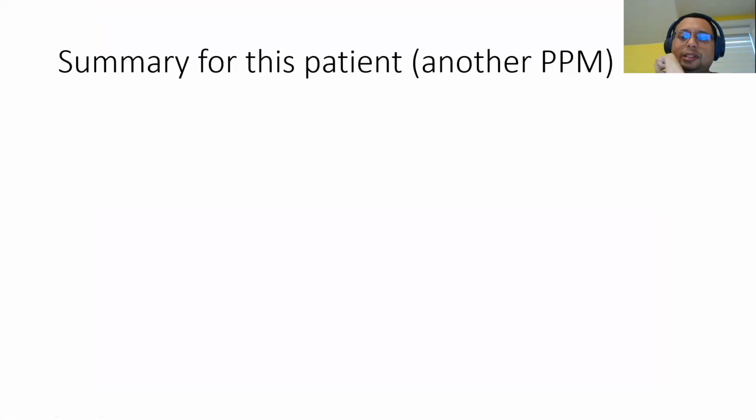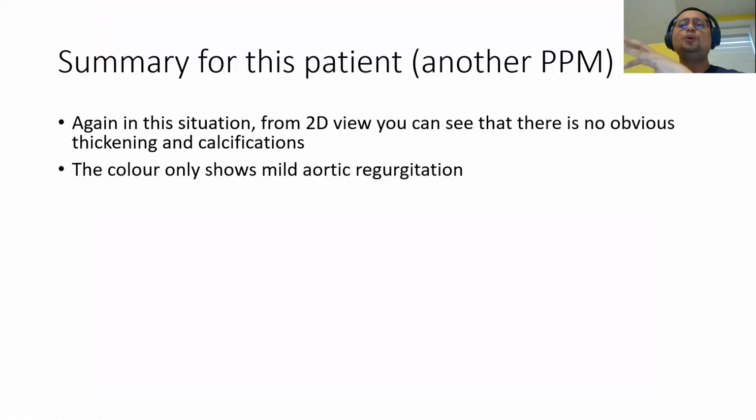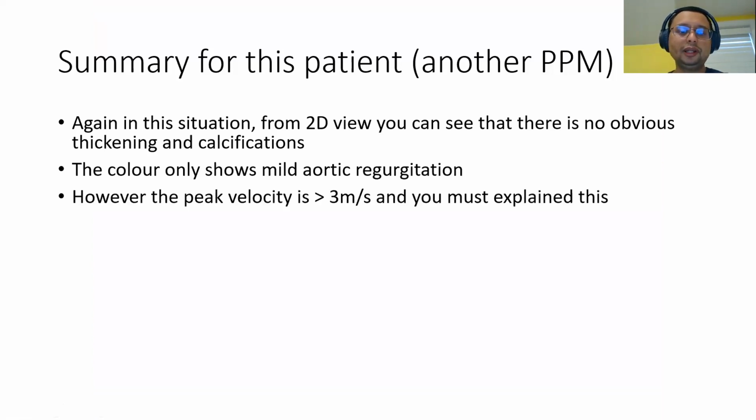So this is another patient prosthesis mismatch, okay? From the 2D view, you can see that the valve looks normal. There is no obvious thickening. There is no calcification. The color only shows mild regurgitation. Moderate and severe, I worry. Mild, I usually don't worry about it.